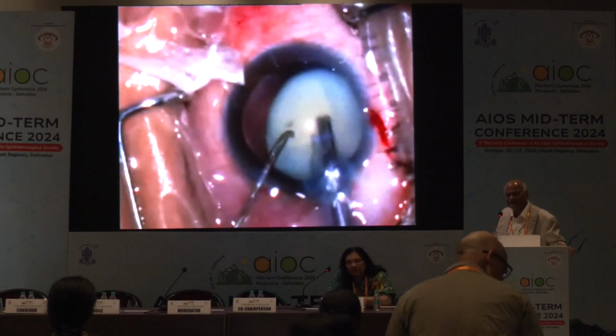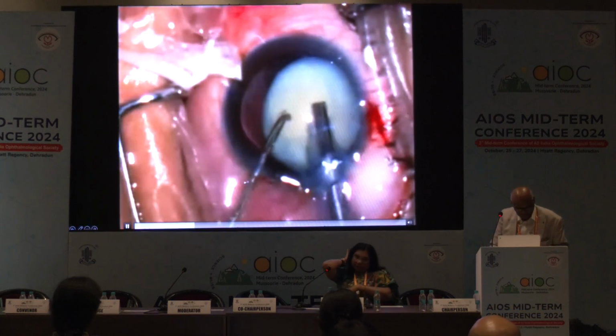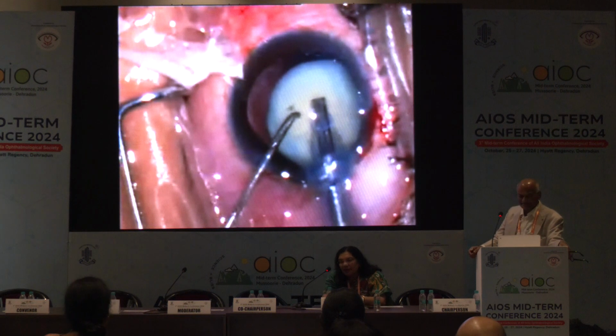What mistake am I making? Can anybody tell me what mistake I am making? It should be embedded. The second thing is, sir, there is no followability, meaning the phaco tip is not able to hold the nucleus. What madam has said is very true.